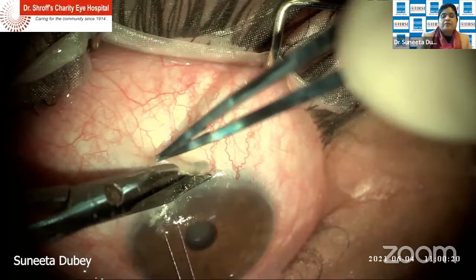Okay. Any other opinions about the site? What I do is not really supranasal, in between the nasal and superior quadrant, but superior, towards the nasal side. So it's just a very subtle one clock hour nasal is what I like to do. Nowadays you're not really exploring large conjunctival flaps, you're making very small conjunctival flaps. So you're leaving the rest of the conjunctiva undisturbed for a future trabeculectomy if required, or a tube on the temporal side.